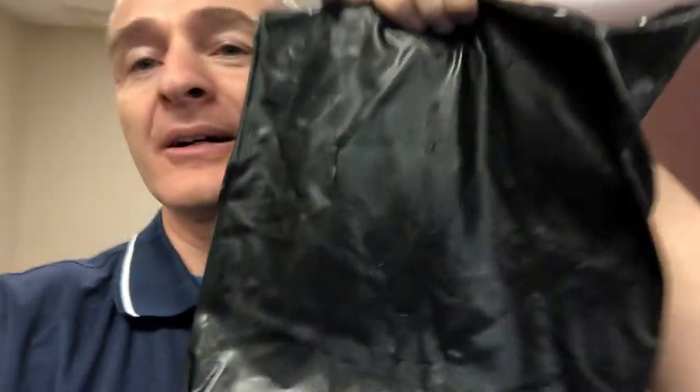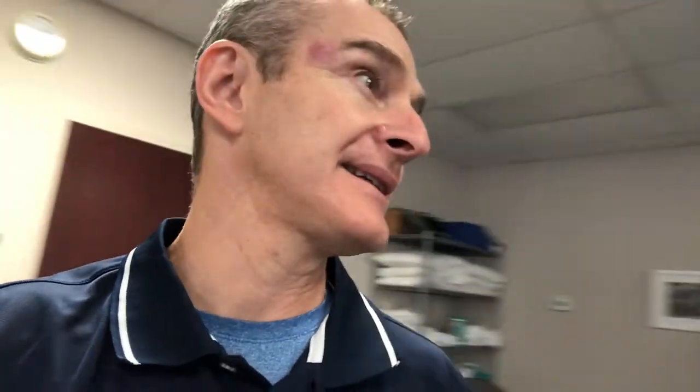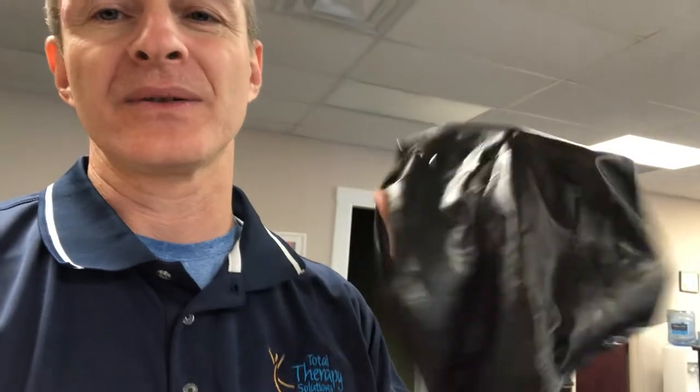These guys are by far my favorite solution for a home rehab situation. You can get them through CoolPac — spelled C-O-L-P-A-C. Basically, regardless of how long they've been in the freezer, they stay soft, they stay pliable and flexible. I'll share a link and put it up here so you can see.